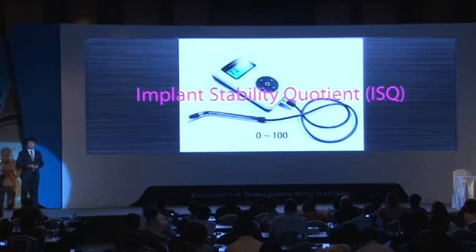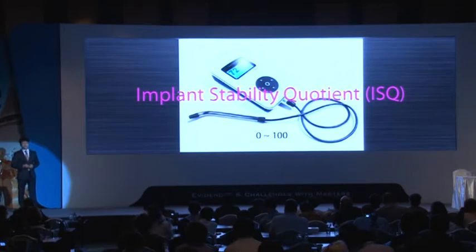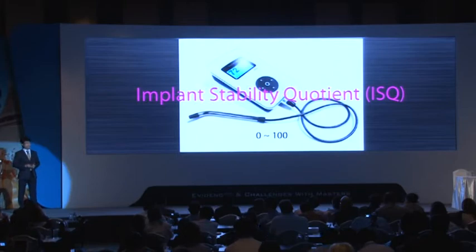For the last 7 years, I performed resonance frequency analysis using the Osstell device on all the implants that I placed. Osstell can provide reliable data about implant stability. Without this kind of test, you have to depend on your personal experiences or follow the conventional Brånemark protocol.